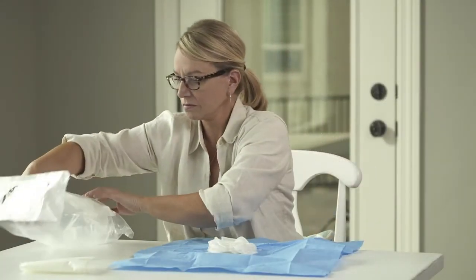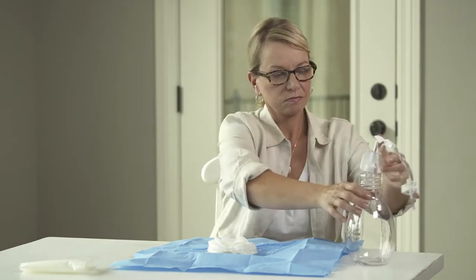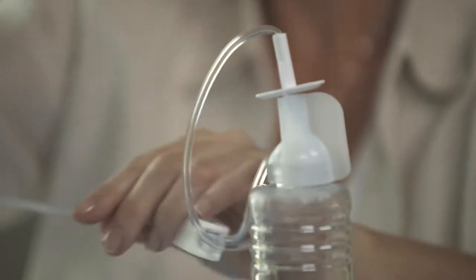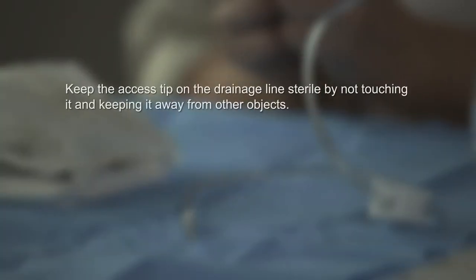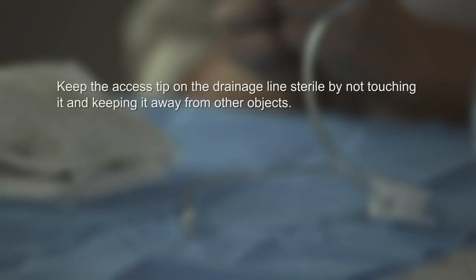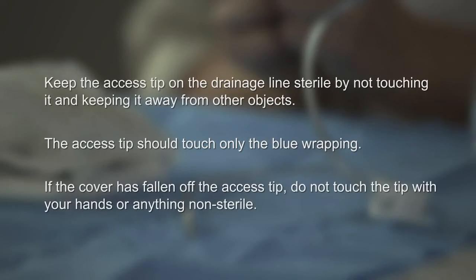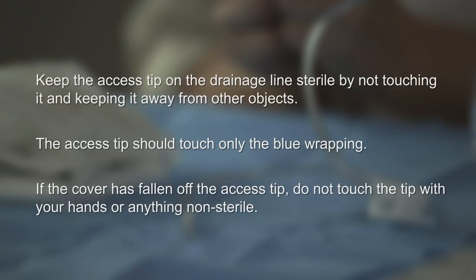Remove the drainage bottle and connected drainage line from the bag and set the bottle on the table next to the blue wrapping. Remove the tape from the drainage line and set the covered access tip on the blue wrap near the other items. Make sure you keep the access tip on the drainage line sterile by not touching it and keeping it away from other objects. The access tip should touch only the blue wrapping. If the cover has fallen off the access tip, do not touch the tip with your hands or anything non-sterile.